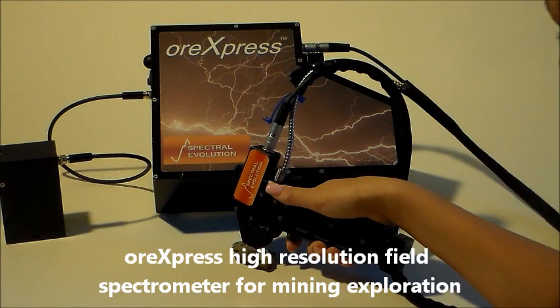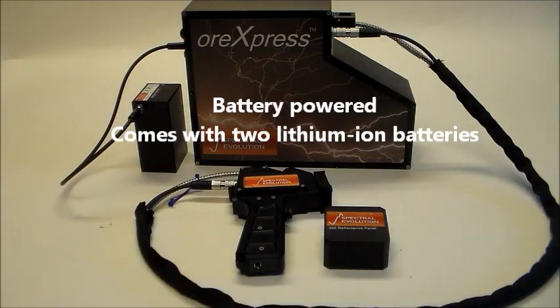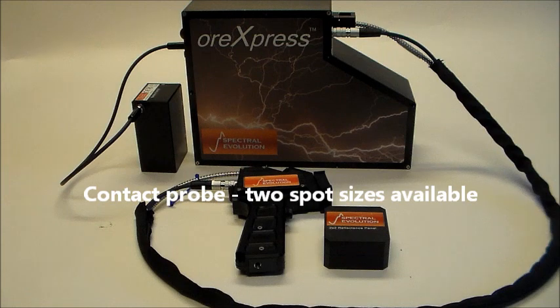The ORExpress is a high-resolution field portable spectrometer for mineral identification and analysis during exploration. It is powered by two lithium-ion batteries for field use. To scan samples in the field, the ORExpress offers two contact probes with different spot sizes: 10 mm and 3 mm.